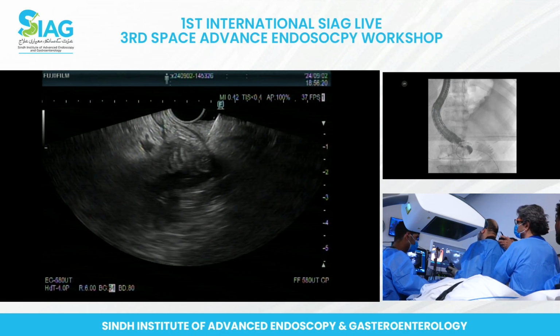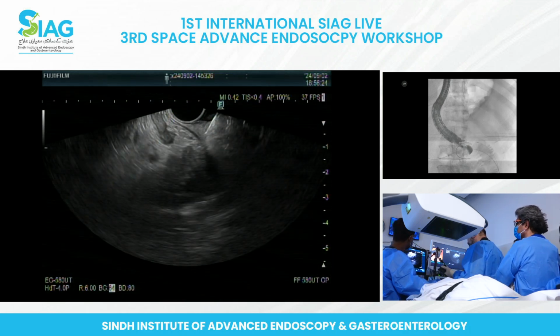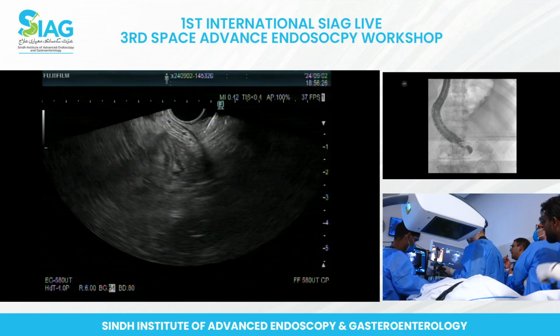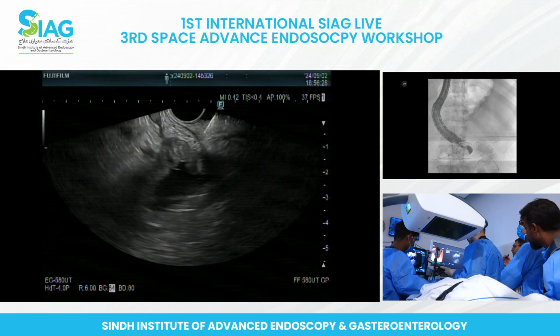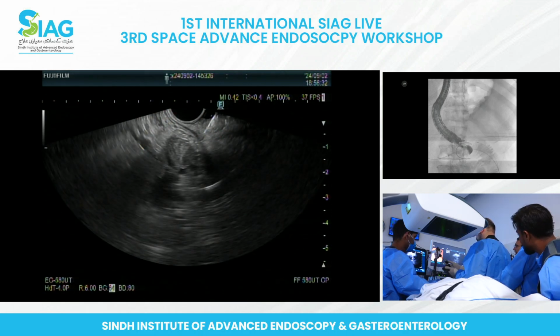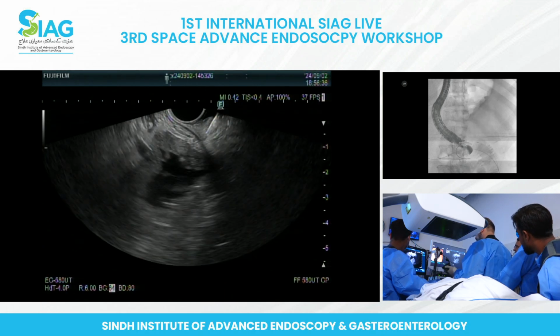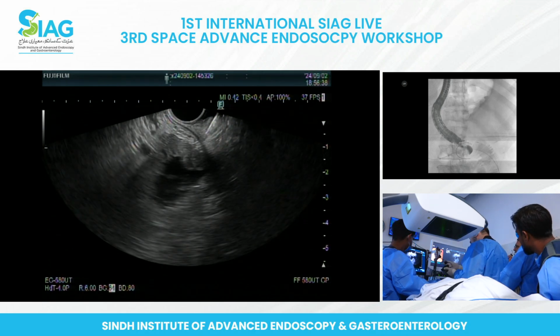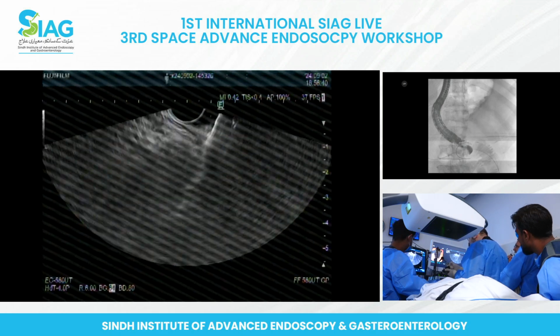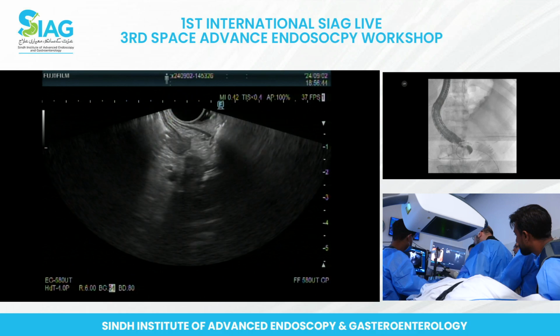Yeah, and then Khalid bhai can actually talk. Can you hear me? Yes, we can hear you. So what he's doing is he's going to get into the best position, looking for a long segment of small intestine in the trajectory of that stent. So just getting ready. He did already a tenting and he's not going to stop. Keep going all the way in.